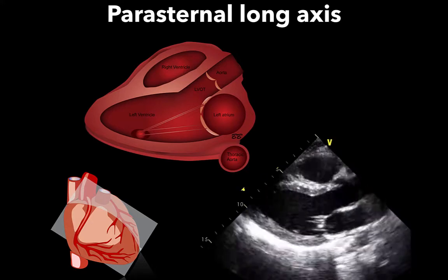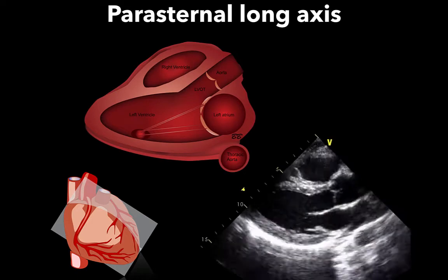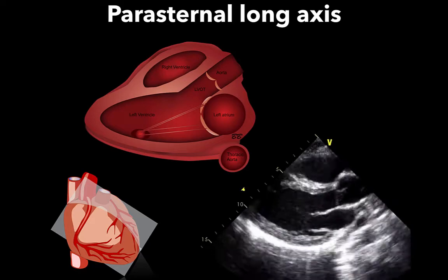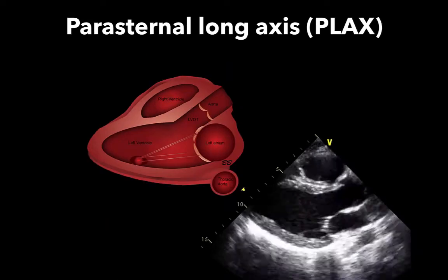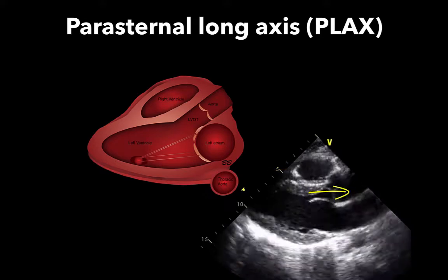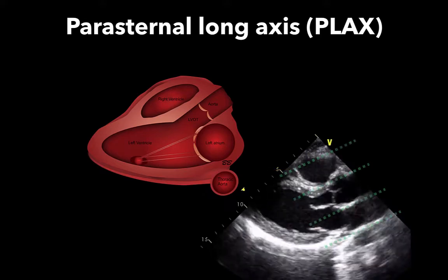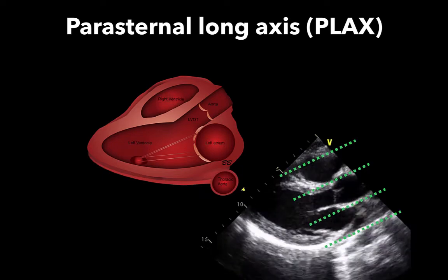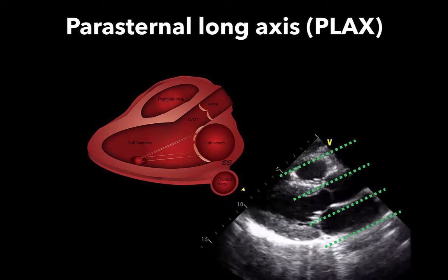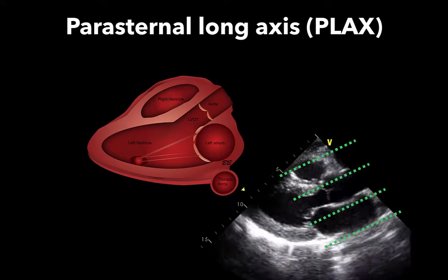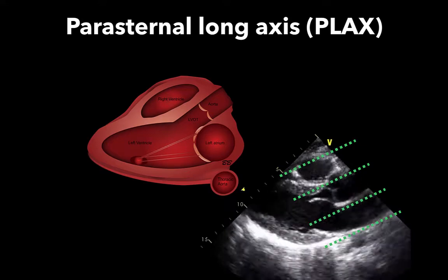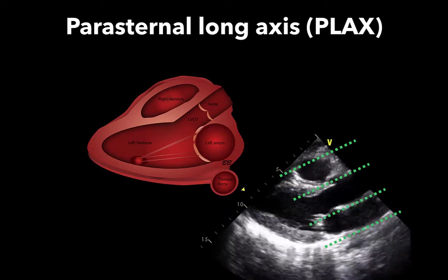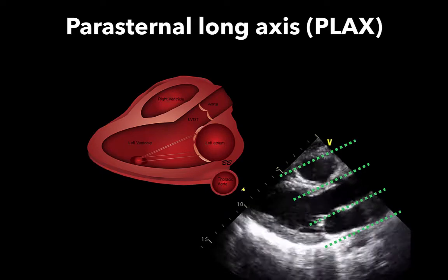You must keep as close as you can to the sternum as possible to obtain this high-quality view, and you will often find at first that you slide away from the sternum. A helpful rule of proportions in this view is to compare the RVOT, aortic root, and left atrium — called the rule of thirds. Each should roughly take about a third of the overall space. Any increase in this ratio may indicate left atrium enlargement, aortic root enlargement, or RV enlargement, serving as a gross rule to help direct you towards a possible cause of patient deterioration.